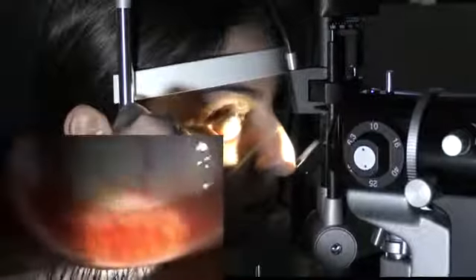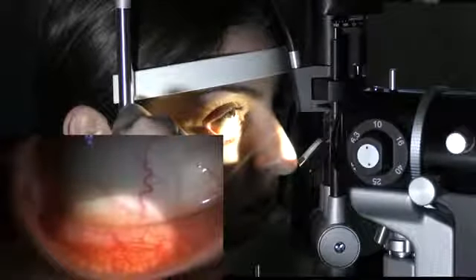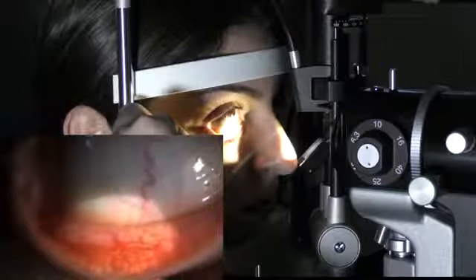Now have the patient look up. When they look up, now you have a better view of the palpebral conjunctiva and inferior fornix. So again, I can look at all the structures here. I can actually see, you can see those stripes there, underlying tarsus. You can see the vessels overlying it.